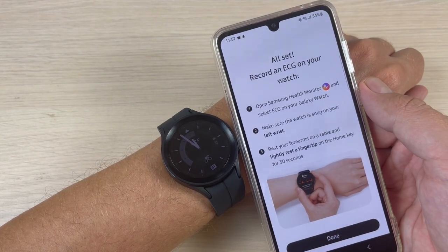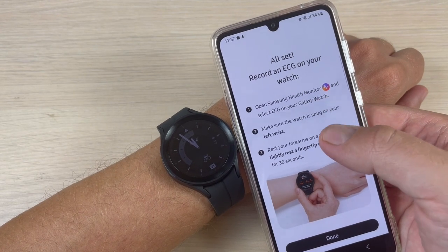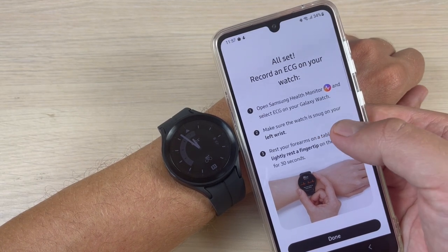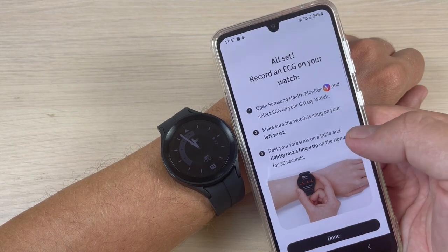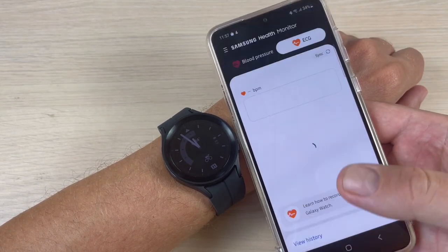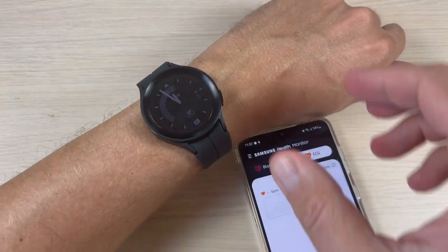Now all set. You need to record an ECG on your watch. Open Samsung Health Monitor and select ECG on your Galaxy Watch. Make sure the watch is snug on your left wrist, rest your forearms on a table, and rest a fingertip on the home key for 30 seconds. Now just press 'Done' and let's go to the watch.